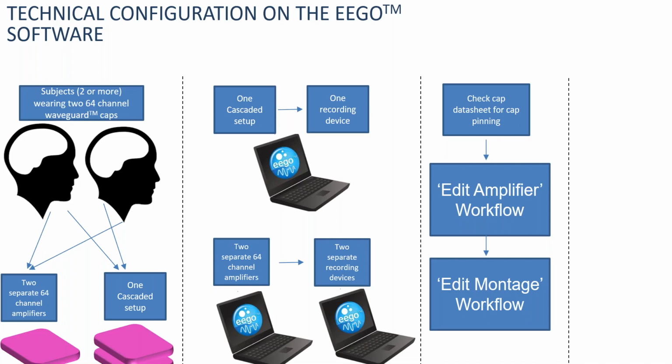It gives you the pinning of the channels and the order of the channels. So in the same order, you would adapt the 128 default setup on the amplifier, for example, for subject 1 and 2. So you would have the same 64 channel sets for 2 subjects, repeated one after the other and contained in a 128 channel setup.